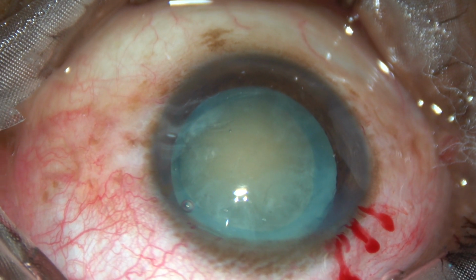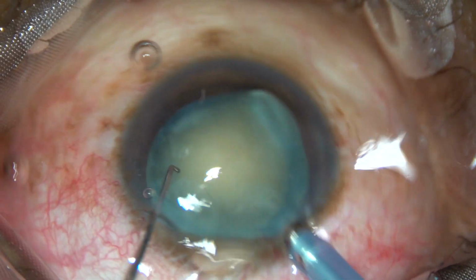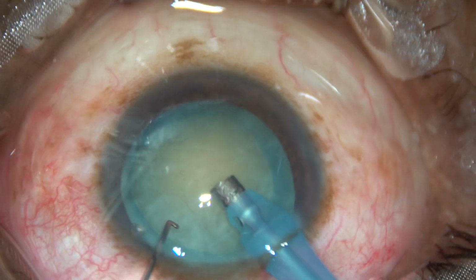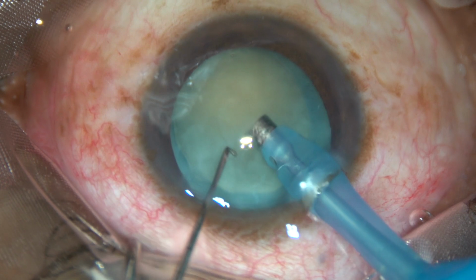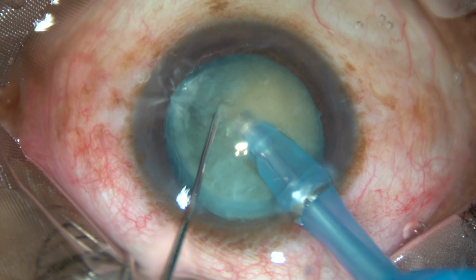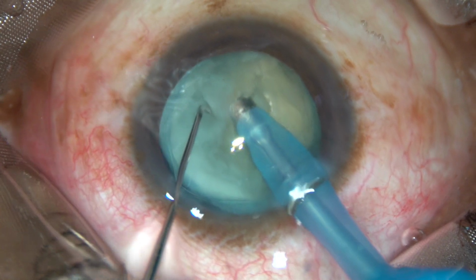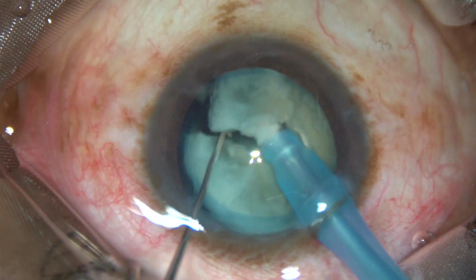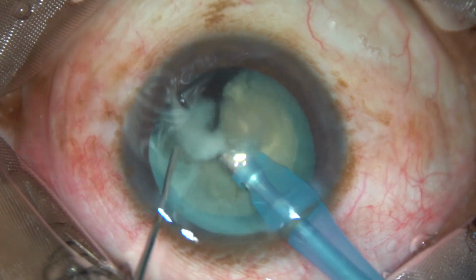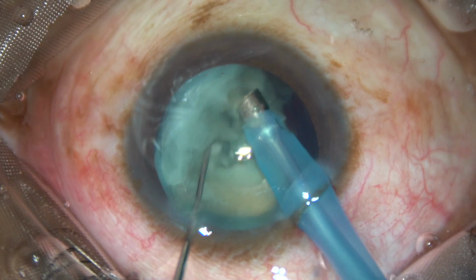Dear friends, when PC rent occurs, we can use intraocular lens as a scaffold and manage the rest of the surgery very nicely. Let us observe this case. In this case, by this time, the previous steps have been done and now nucleus is being managed. The nucleus has been chopped and it is being managed. It is being emulsified and managed.